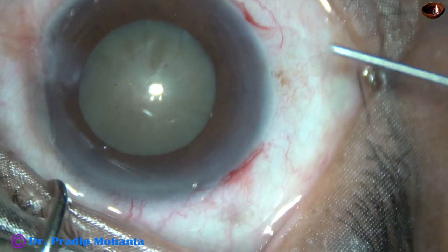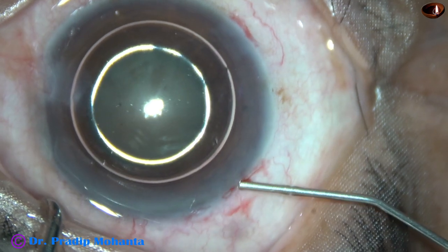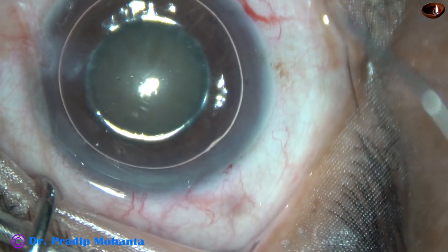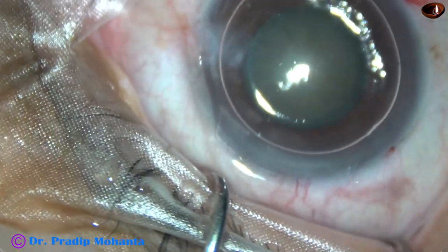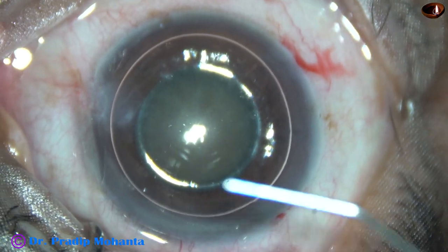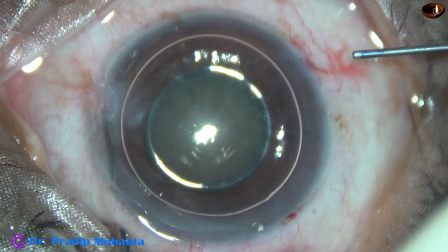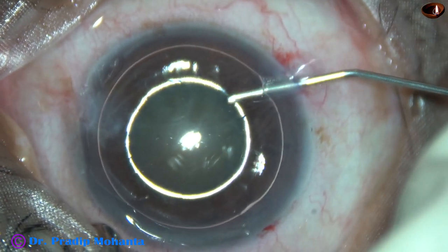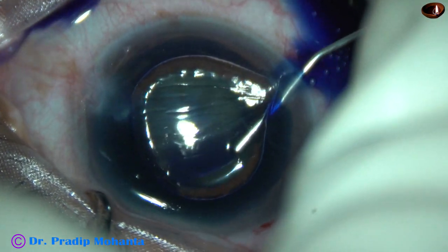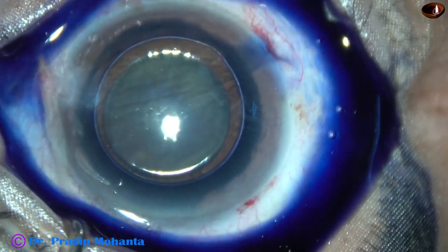My aim is to stain the anterior capsule with trypan blue dye. I inject an air bubble and fill up the anterior chamber with the air bubble. Beneath this air bubble, over the anterior capsule, I apply 0.06% trypan blue dye. The dye is applied over all parts of the anterior capsule so that uniform staining occurs.